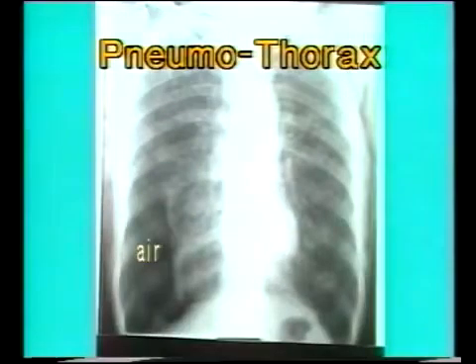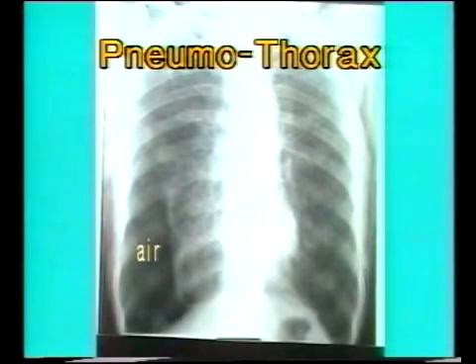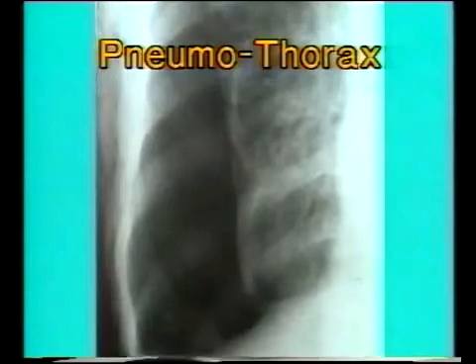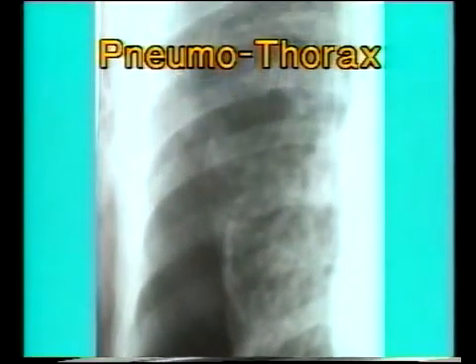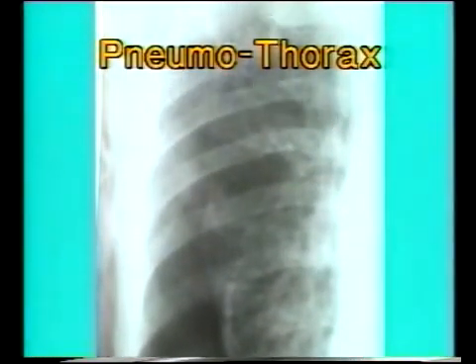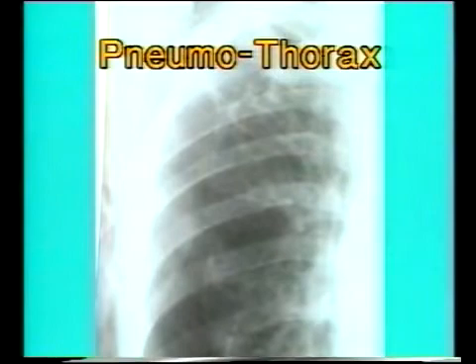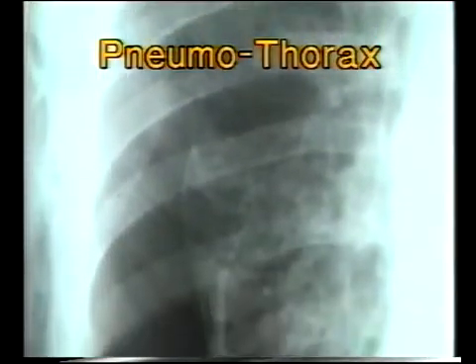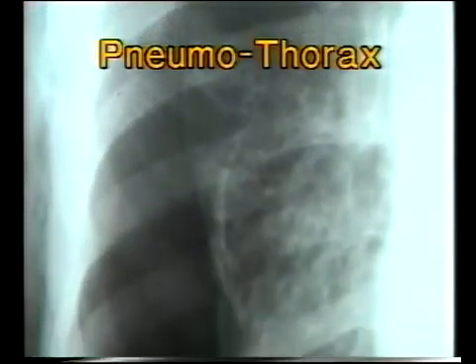This is another X-ray showing air in the right pleural cavity without significant shift of mediastinum. Note the peripheral radiolucent area on the right side and the thin line of lung border representing the visceral pleura which demarcates the collapsed lung from the air. Note the absence of lung markings in the dark radiolucent area.